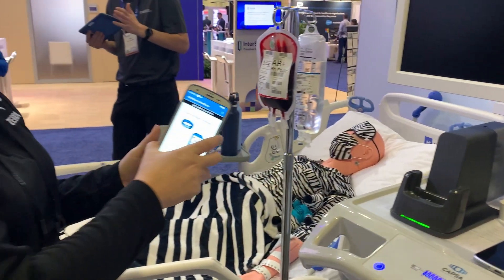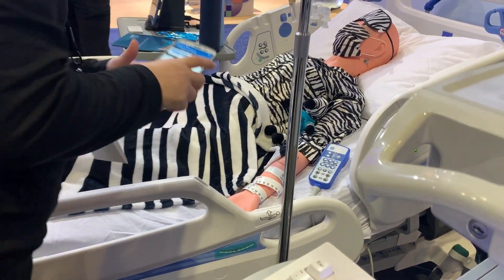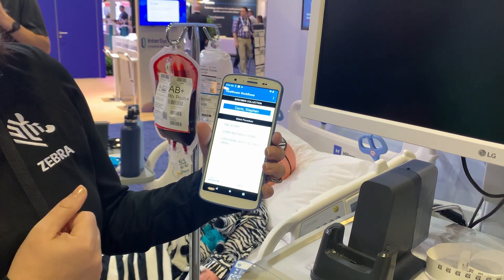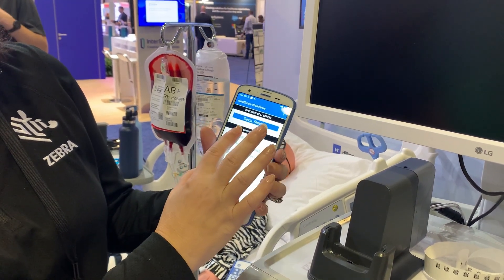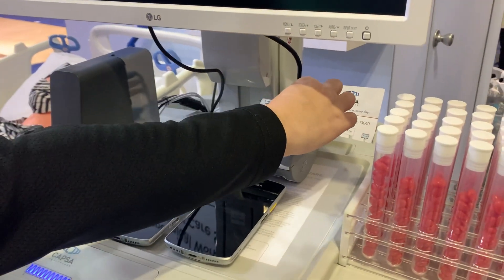So I am going to scan a wristband on our patient. You can see the doctor has prescribed a few labs to be run, so I'm going to go ahead and draw blood from our patient and print the label here on the printer.